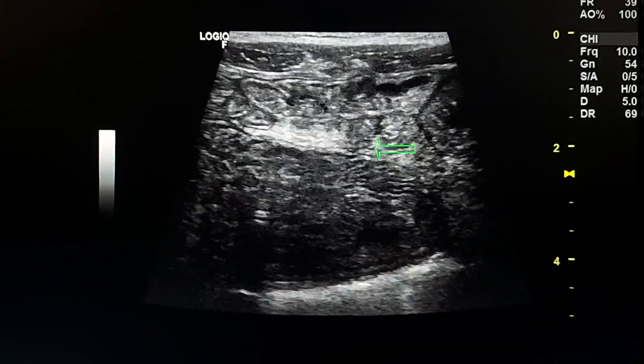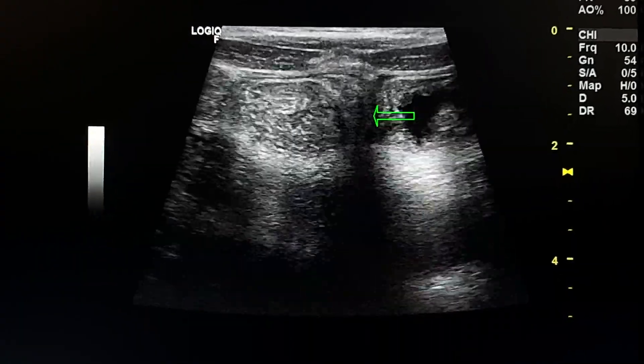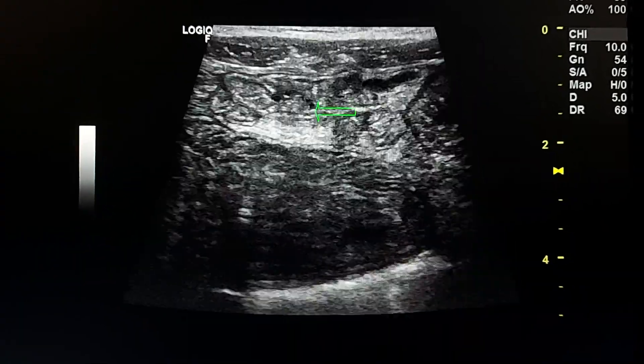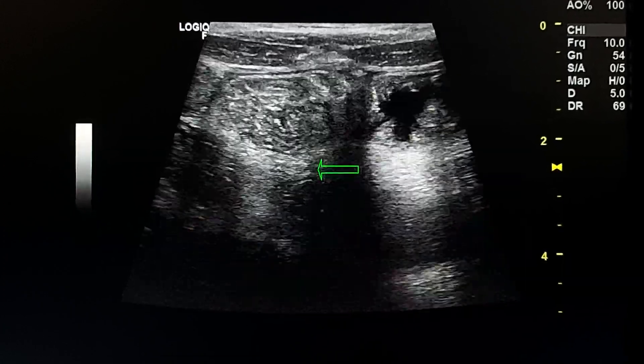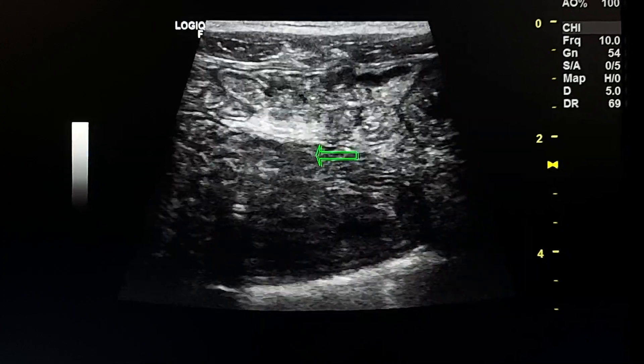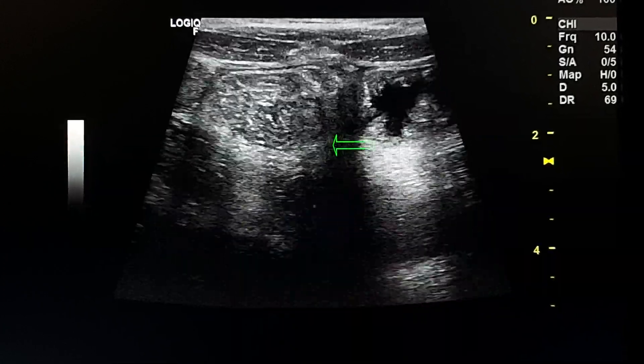Another view. Here are small bowel loops and here is echogenic mesentery.